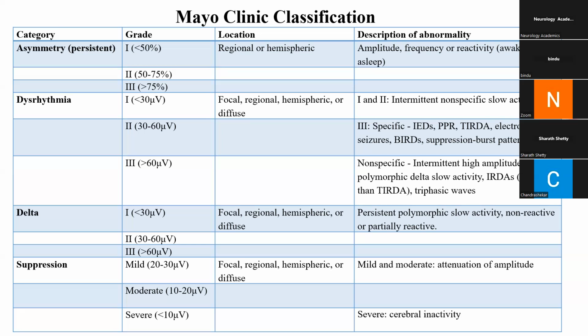Common mode rejection is the physiology behind your salt bridge. The reasons may be umpteen. The salt bridge may be due to various reasons. Salt bridge is a colloquial term, used because there is a bridge formed by the conductive paste. But what is really happening is that the amplifier cannot detect an activity which is the same, because two electrodes come together and come out as an output, and that becomes one channel. I always tell you, the electrodes are there, then there is a channel, then there is a chain, and then it becomes a montage. So when it comes out, it is zero. Zero means it is a flat line. This is what is known as CMR, common mode rejection.